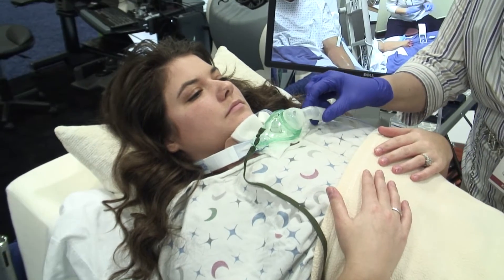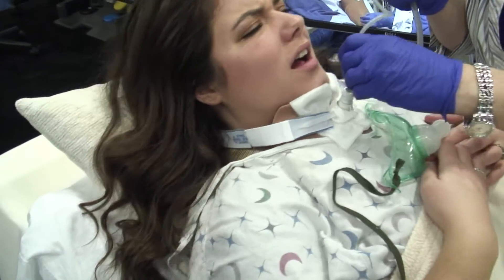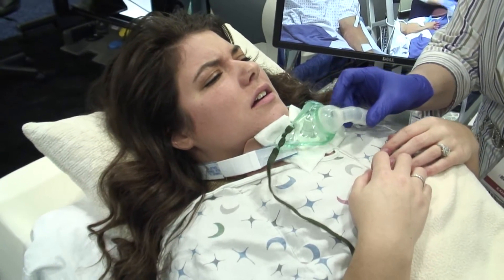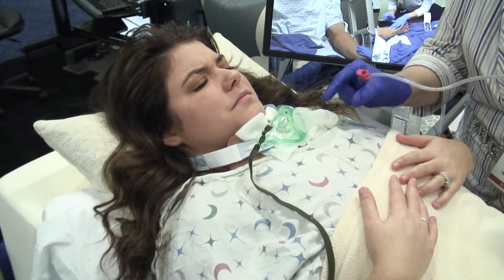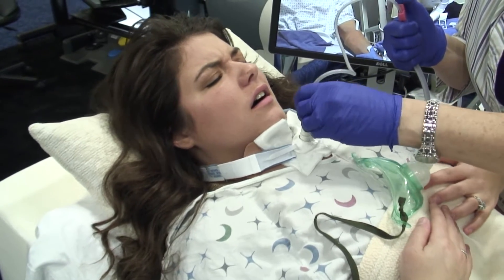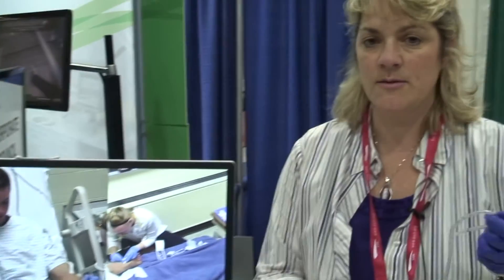Take a couple deep breaths. You ready? — I'm sorry. Did that hurt? I won't do it again. One more time — I won't go down as far this time. And so if that sensor is not hit, go ahead and cough for me. But if the sensor is not hit, the patient knows to just respond with small coughs so that they can get the mucus into their upper airways.